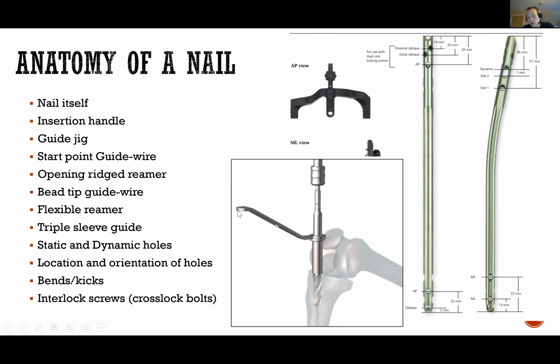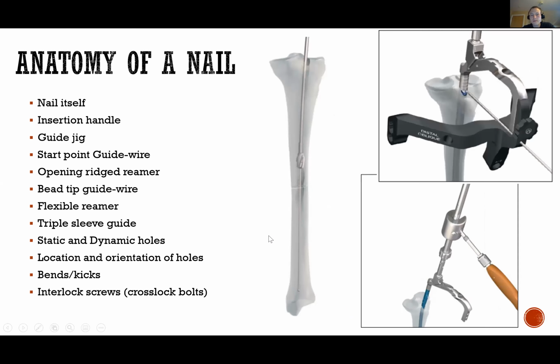And along with the rigid reamer, there's a soft tissue protector. This slides in through the incision that we've made so that as you're spinning this aggressive reamer, you're not destroying the remainder of the knee joint, for instance, or destroying the gluteal muscles around the hip. After we've placed our beaded tip guide wire, which you can see down here going all the way down the bone, then we use a flexible reamer, which can flex to the different contours within the bone and expand the medullary canal.